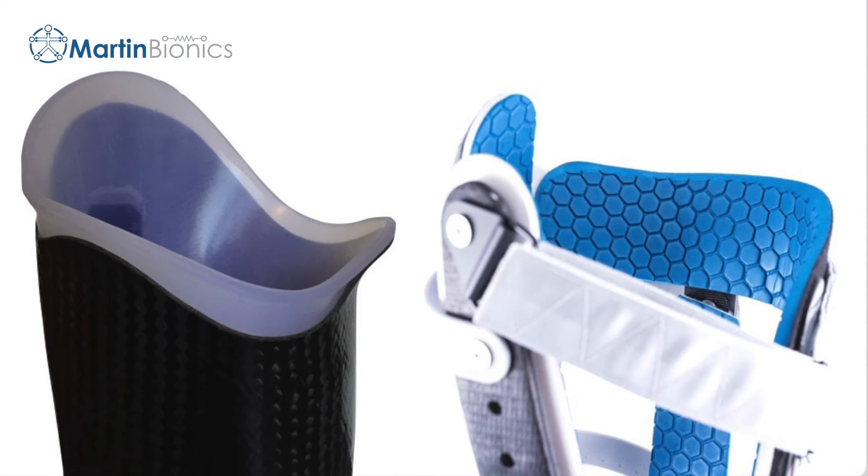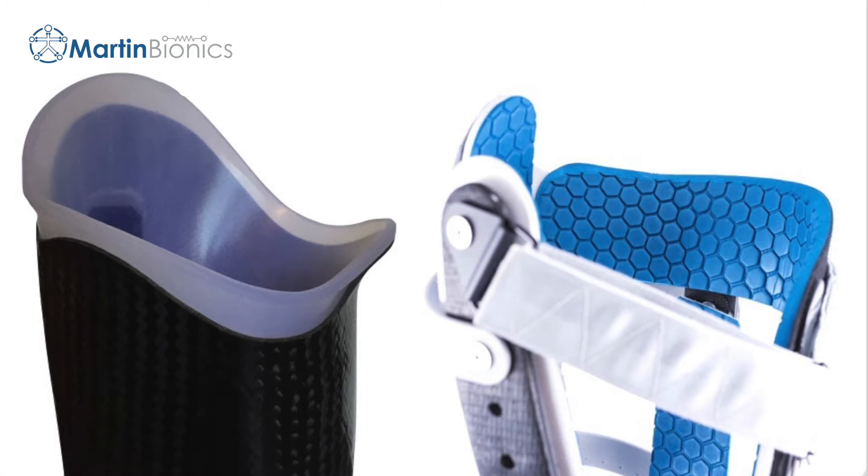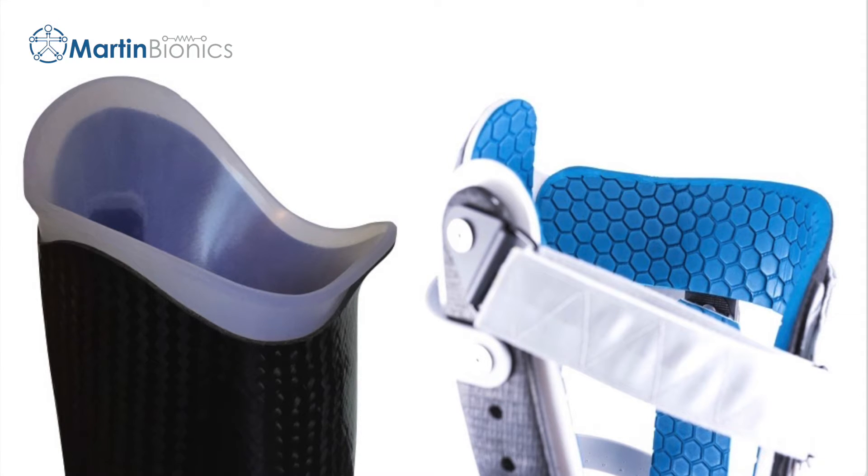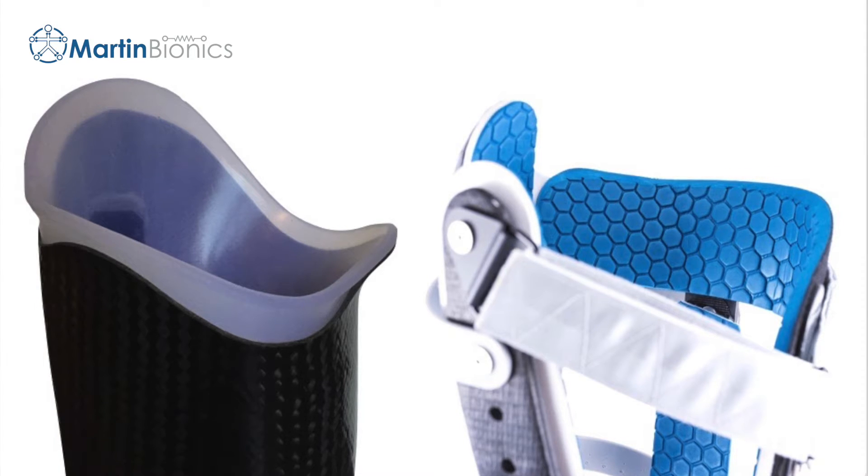When you compare the Socketless Socket brim with that of a conventional socket, you can see just how different they are. By making the brim out of webbing and soft foam padding versus traditional rigid plastics, it is now able to conform to the user's body versus the body having to sit into a static shape. Our bodies are dynamic. We believe the socket and especially the brim should be dynamic as well.